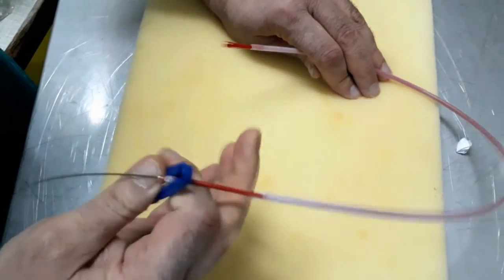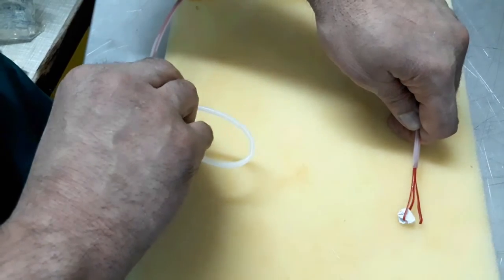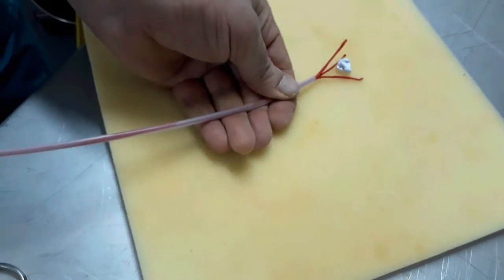The three prongs forceps is opened and closed by mobilizing the handle. It is tried with a ball of paper. The three prongs catch the ball.